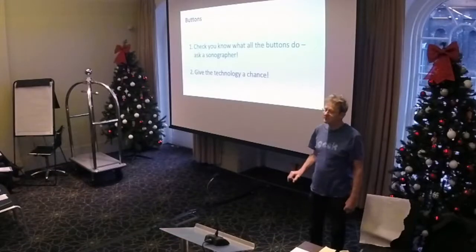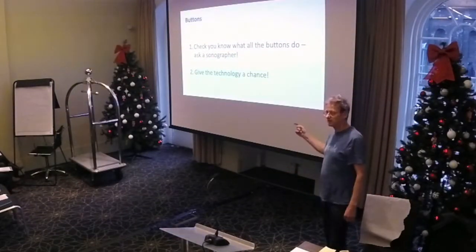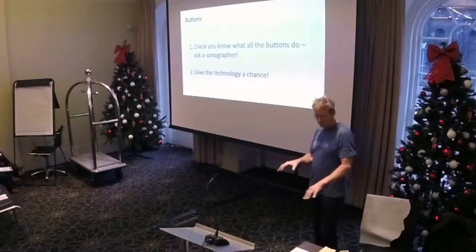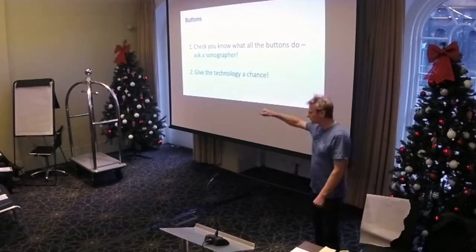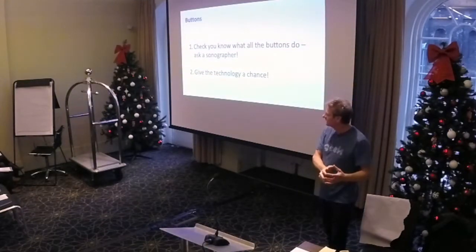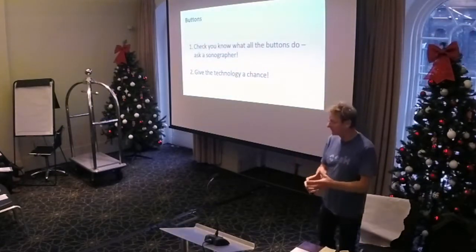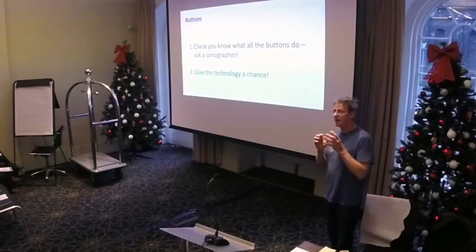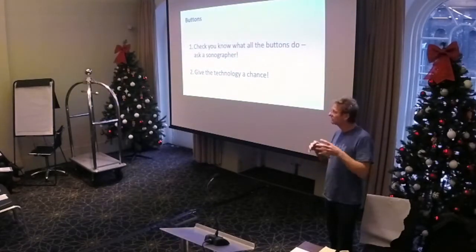Some stuff that you need to know before you scan, and the two things are, know what the buttons do. When you're watching a sonographer scan, he or she is changing stuff the whole time. When you scan, you're looking at the screen, you're not altering the buttons. So why are they doing that? It's because they're giving technology a chance. The computing power that's going on in the scan machine is amazing, and there's ways of optimizing that.